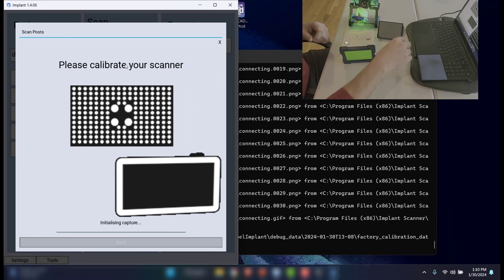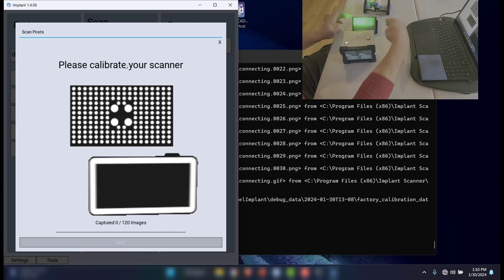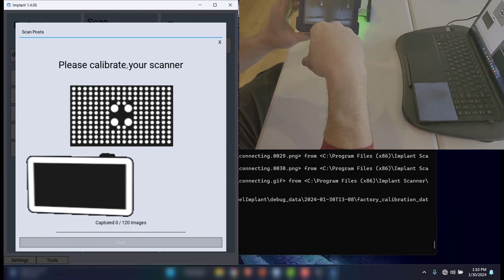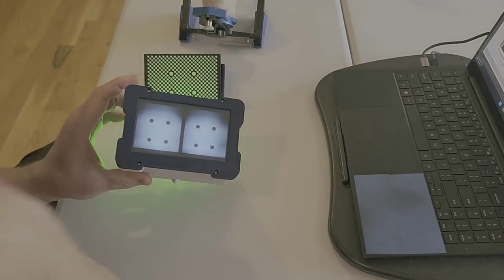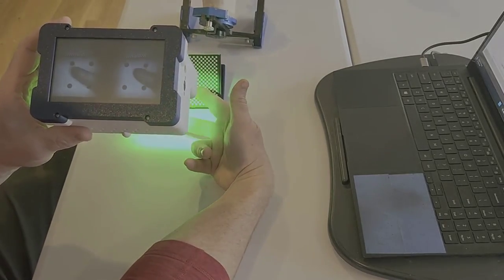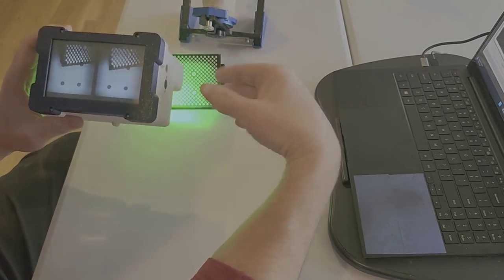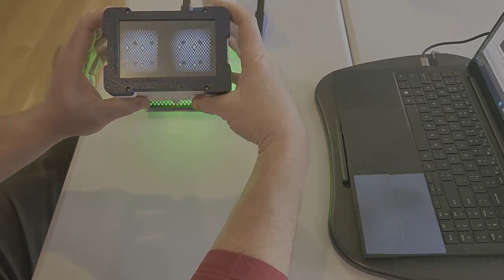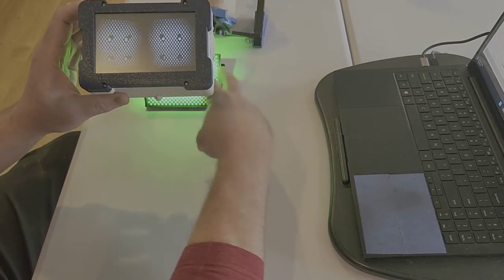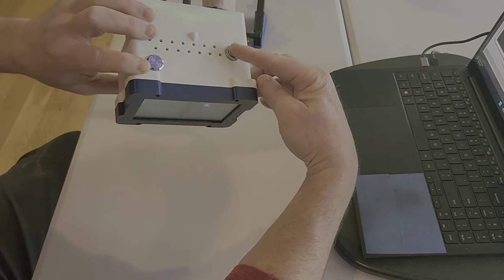All right, so the first thing it wants me to do, because I forced it, is to recalibrate my scanner. So I'll put this over here where hopefully you can see it pretty easily. Notice that if I put this against the white tabletop, you see there's 4 kind of shadowy dots on each side of the screen because there's 2 cameras. And so it's the convergence of those cameras that is allowing it to pick up this data for the photogrammetry processing. So I can zoom in, zoom out, but basically I want to match up size-wise to approximately those 4 dots that are on the calibration plate. And once I do that, this is your trigger to start capturing.